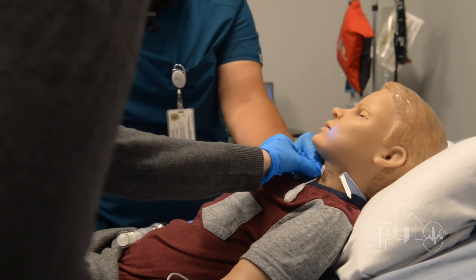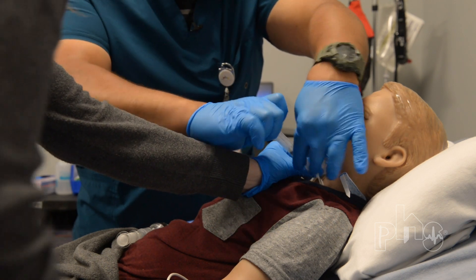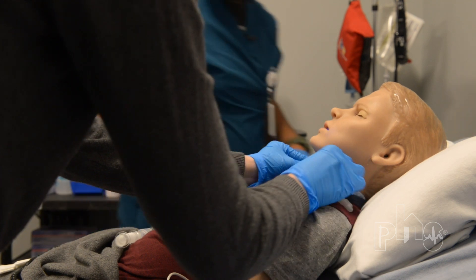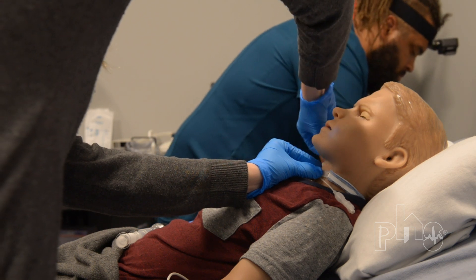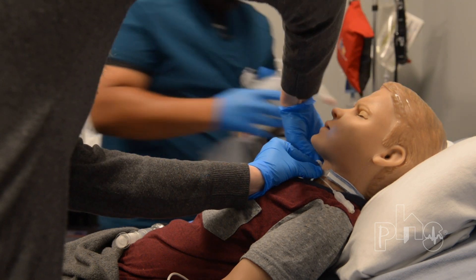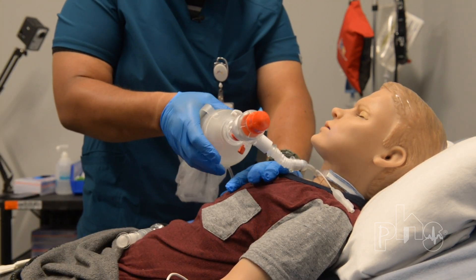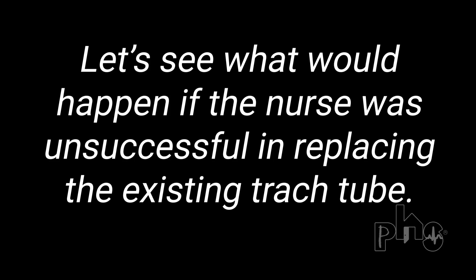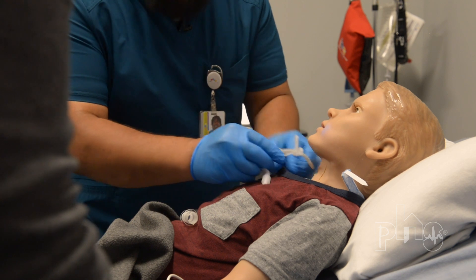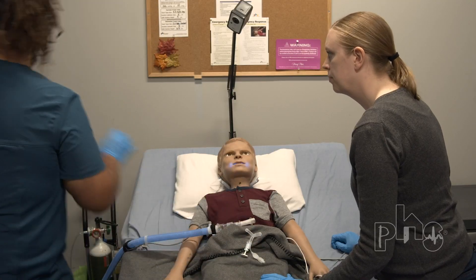Mom, if you could hold that for me. I'm going to re-inflate his cuff and get him some oxygen. We're going to try to put this trach back in. Mom, it looks like this trach isn't going in. I'm going to have to get the downsize. It's okay, Hal. Hal, you're doing great. Here's your new trach, Hal. There we go. Mom, could you hold that for me?